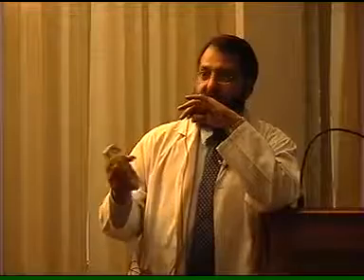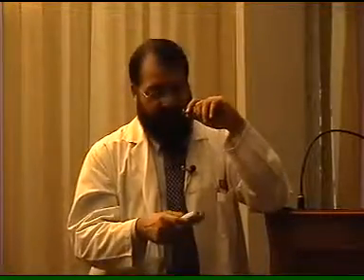And if that PR interval is shortened, it means it's not going through the AV node, it's bypassing the AV node, and that's called pre-excitation. And there are 2 or 3 syndromes such as WPW syndrome, Wolff-Parkinson-White syndrome, and one of the ECGs that was shown, delta wave, that slurring on the upstroke, was WPW syndrome by Dr. Masood. So you have to look at this PR interval.